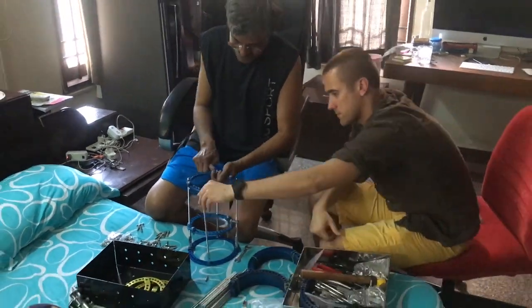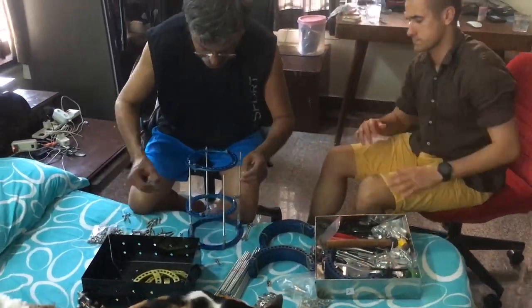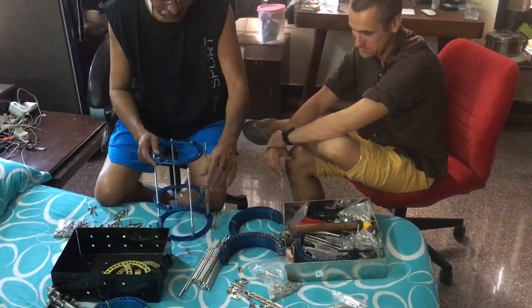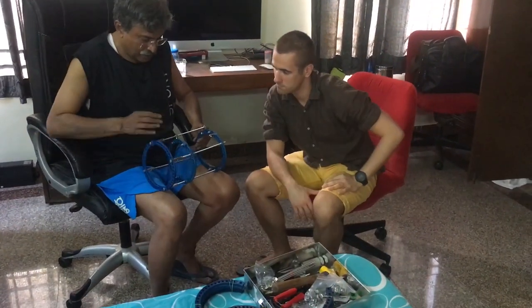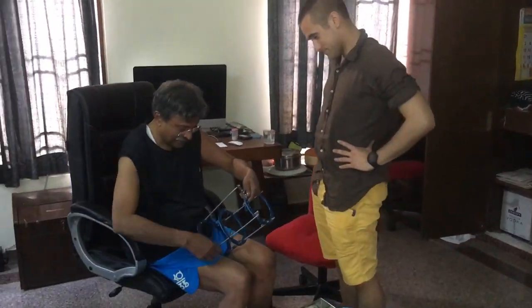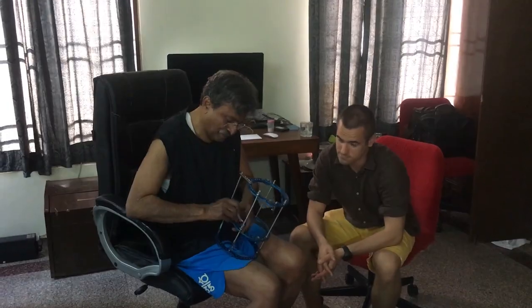A pre-fabricated construct using two smaller distal rings and one larger proximal ring is assembled. The top and bottom rings are the fixed rings, while the transport ring or middle ring is a mobile ring that will move from proximal to distal. The frame is assembled such that on inserting into the leg there must be more space posteriorly than anteriorly.